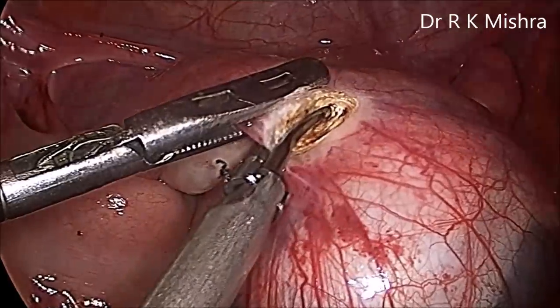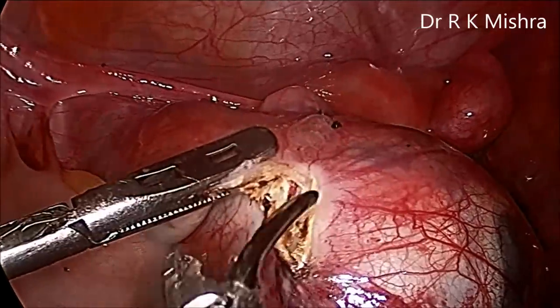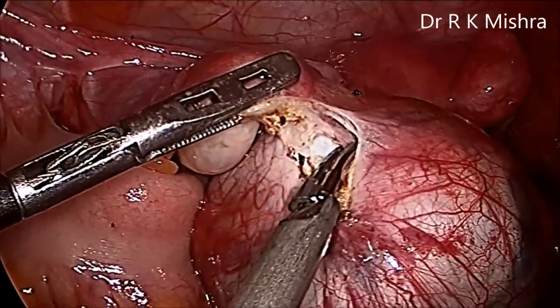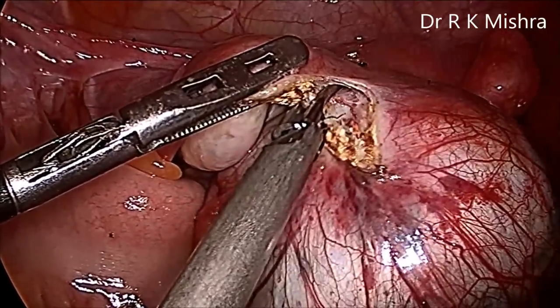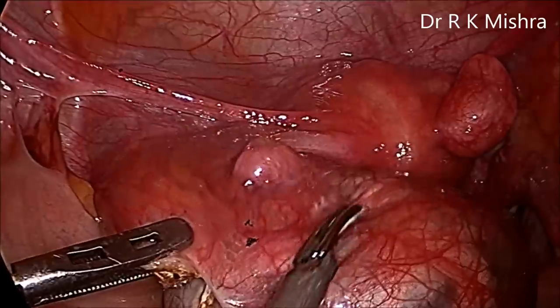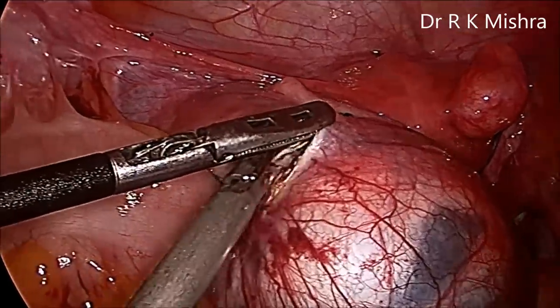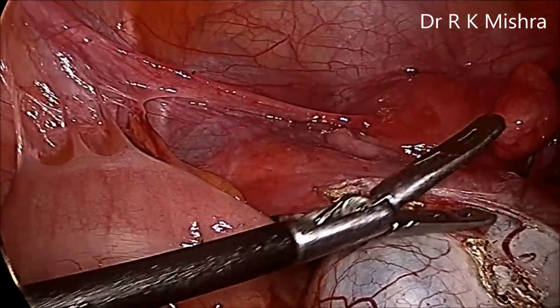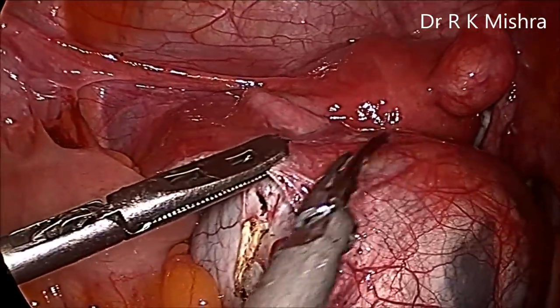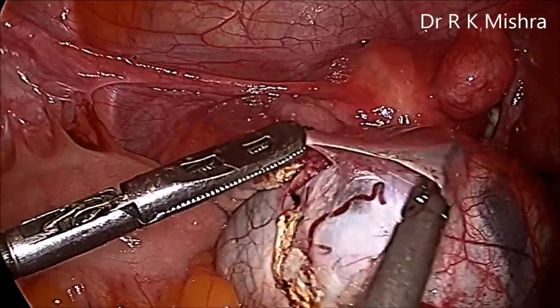Our aim is that the ovaries should not get ruptured during the ovarian cystectomy, and we are getting a good plane. The tube — we can see it just like a para-ovarian cyst. The fimbrial end of the tube can be seen attached near the ovarian cyst, so care should be taken that the fimbria of the tube is not damaged. The left hand has the atraumatic grasper and the right hand has the harmonic scalpel through which the dissection is carried out. Ipsilateral port position is used, although one contralateral port will also be introduced later for the myoma screw during laparoscopic myomectomy.